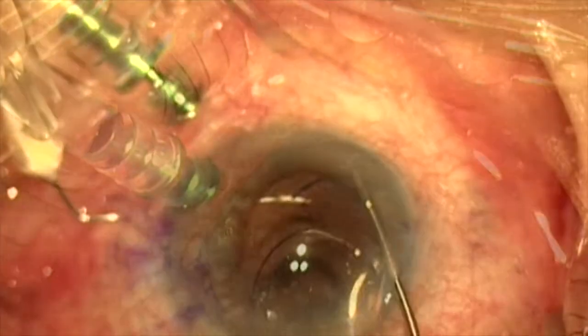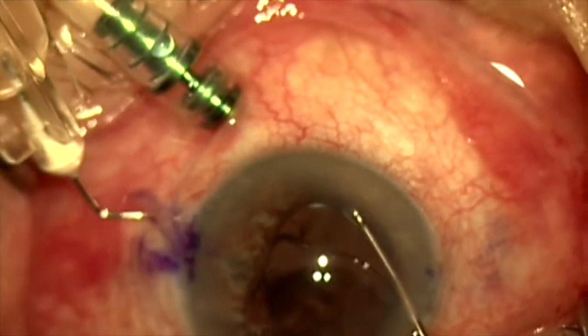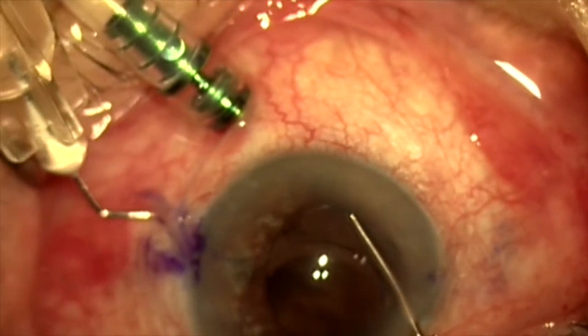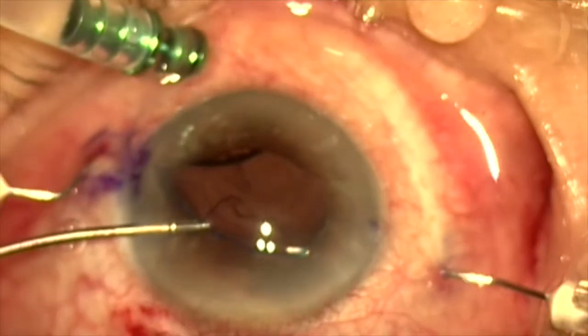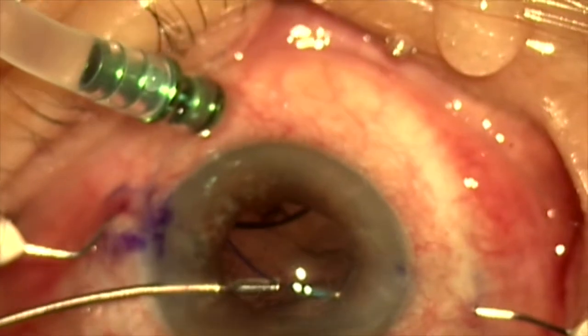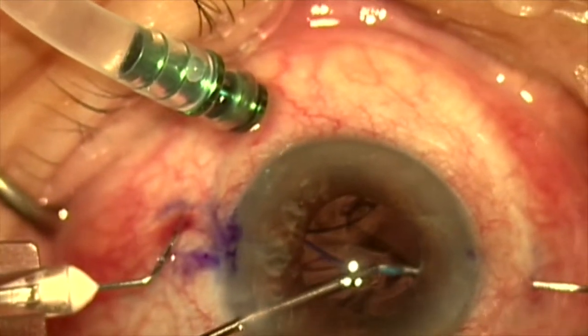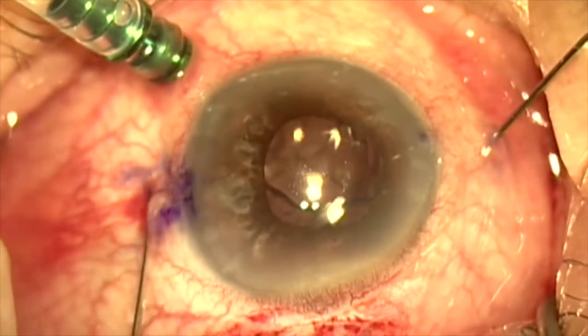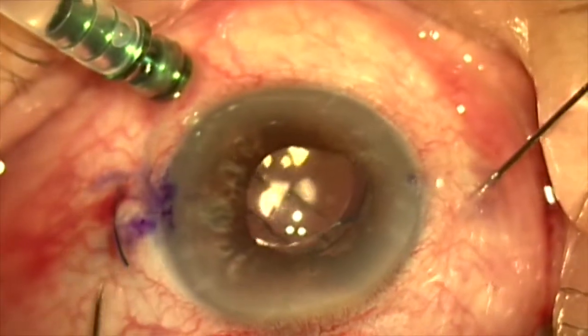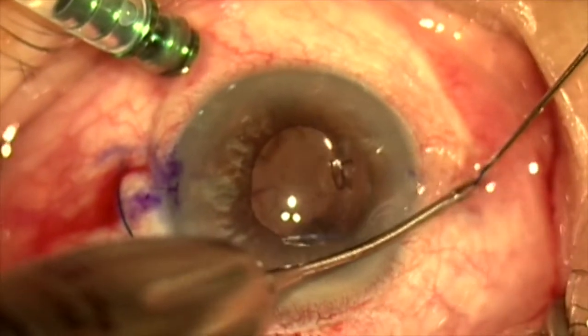We're now going to inject a Zeiss CT Lucia 602 three-piece lens, and we're going to do the standard Yamani intrascleral haptic fixation technique. We're using two 30-gauge TSK needles, inserting the distal and proximal haptics into their respective 30-gauge needles, and externalizing the haptics on each side.